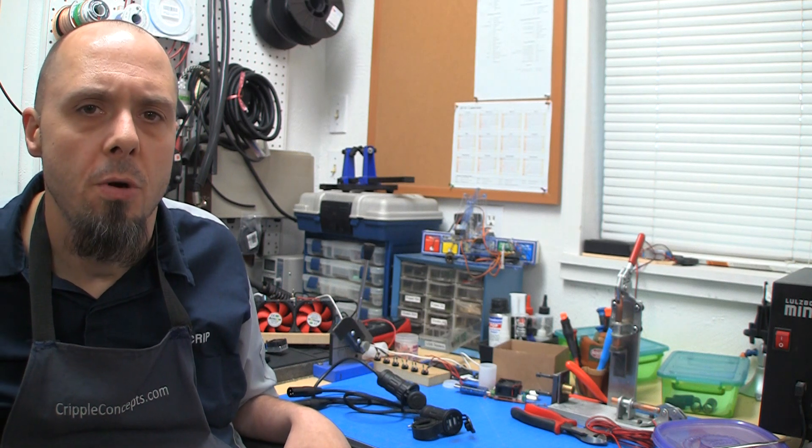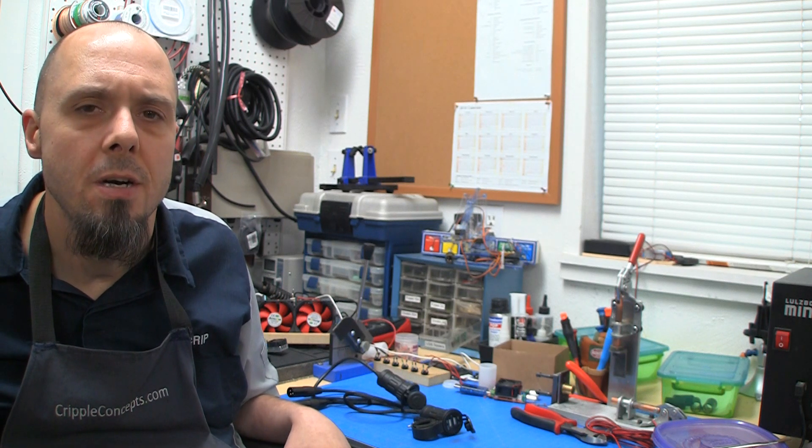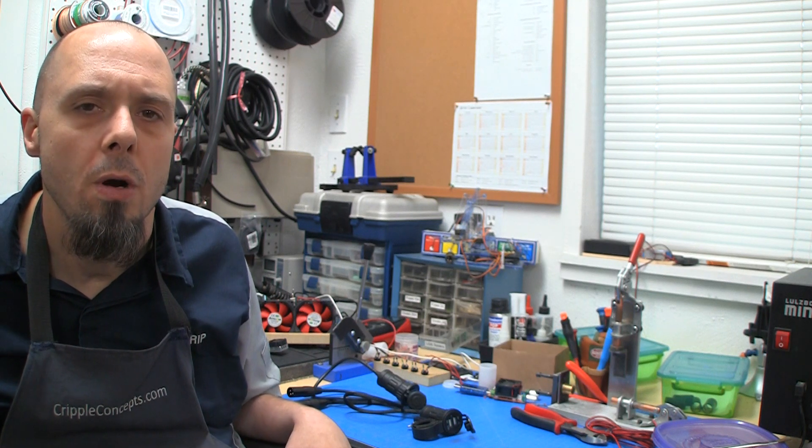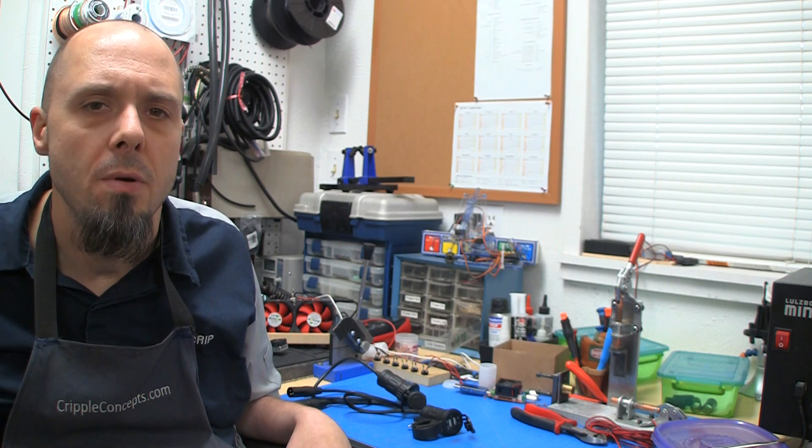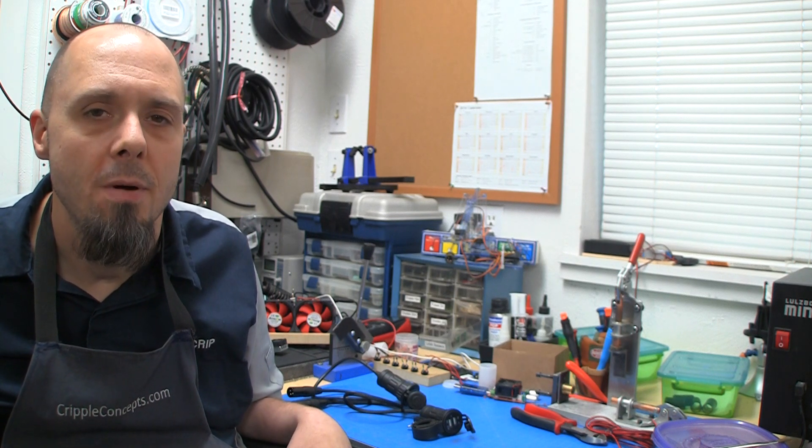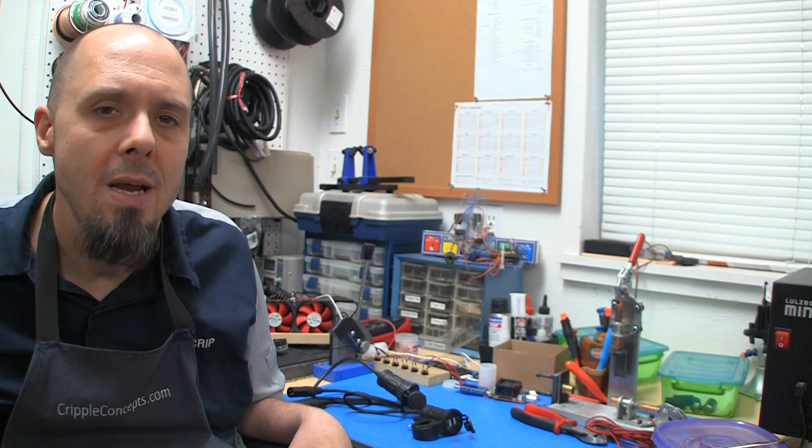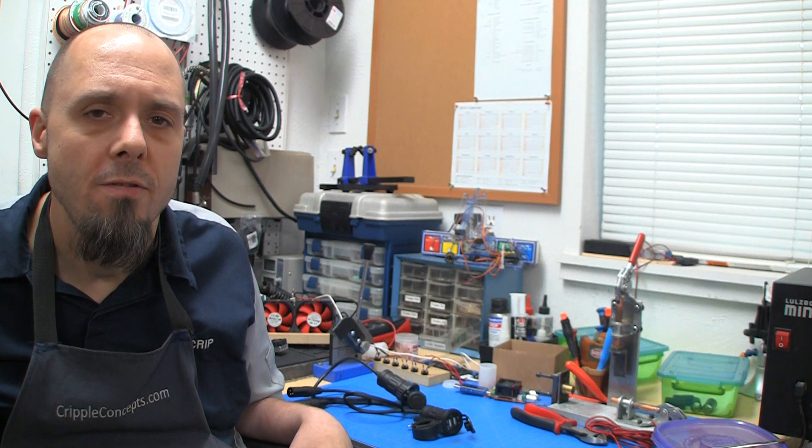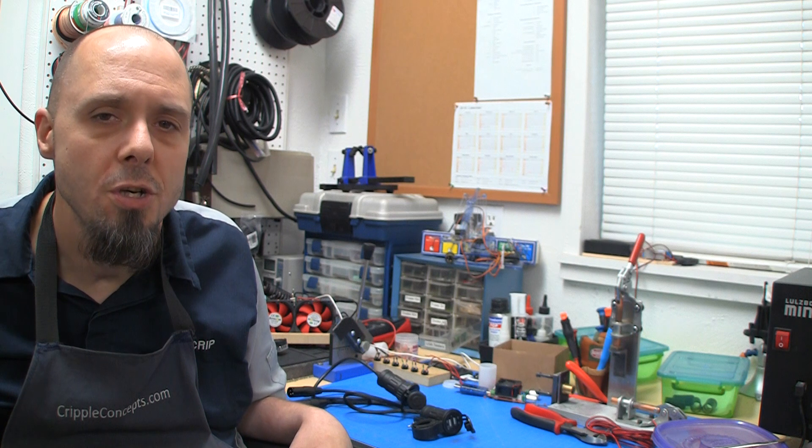Hey everybody, Josh with Crippled Concepts here, just doing a quick review. After my last charger review, the company called ChillCare, I believe that's how you pronounce it, out of Canada contacted me and asked if I'd do a quick review on their chargers too.